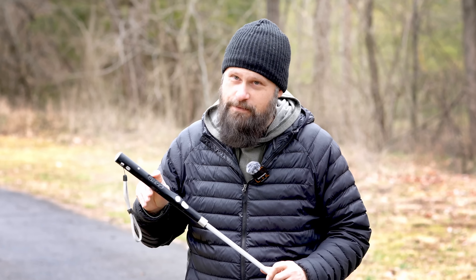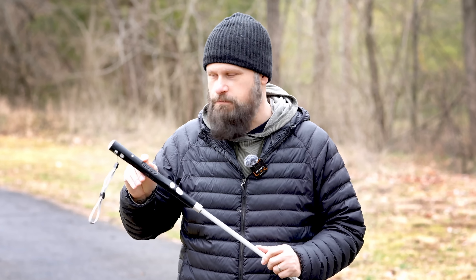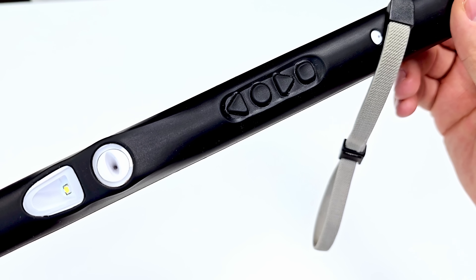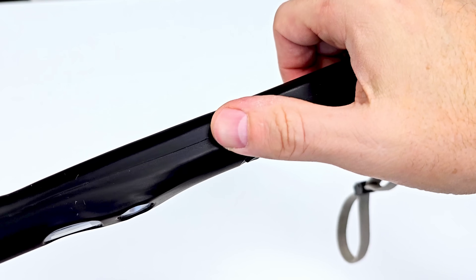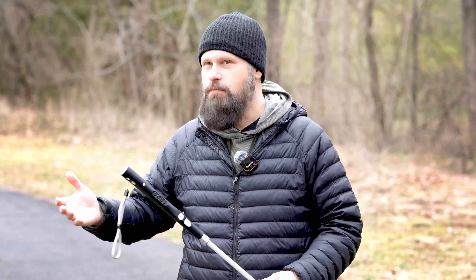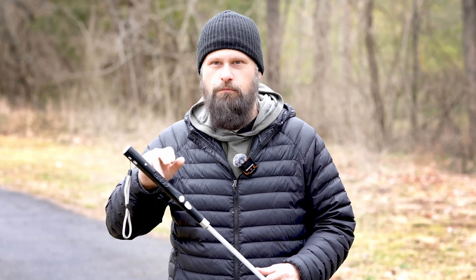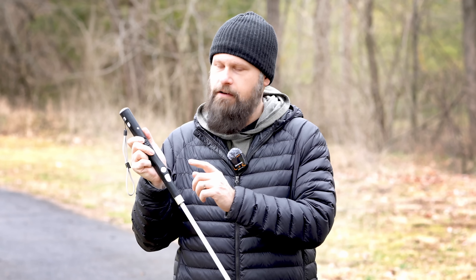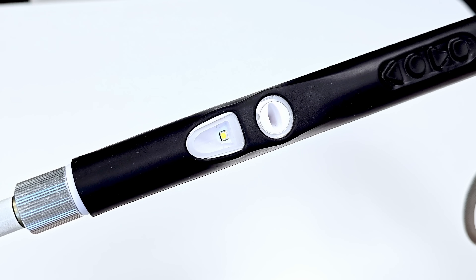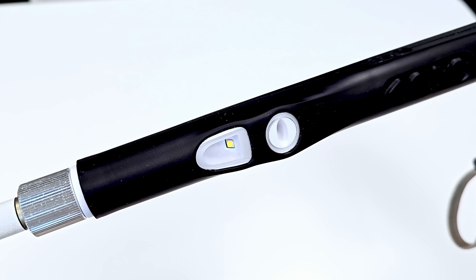One of my favorite changes on the Version 2 smart cane is physical buttons. I always prefer physical buttons over any type of touch panel or capacitive buttons. In the BVI community, we touch everything — we're very tactile — so it just makes sense to have physical buttons. This is going to make it much easier to reliably control the cane while on the move.